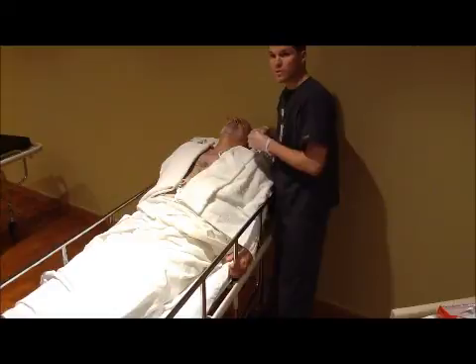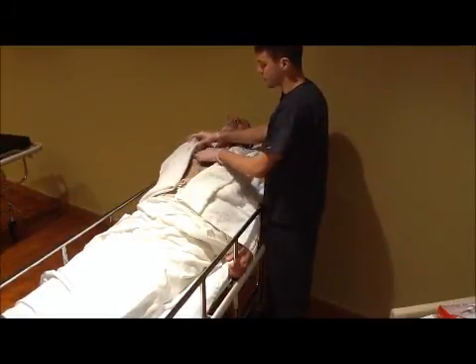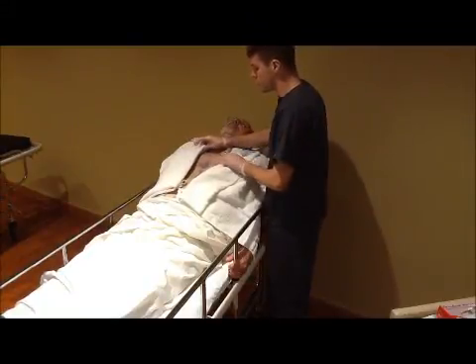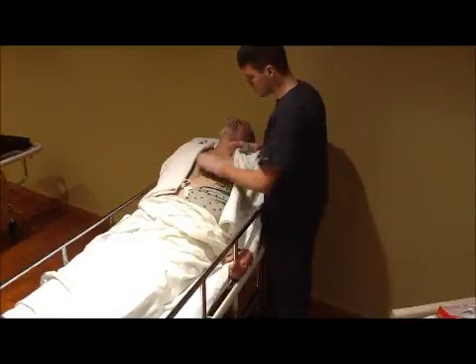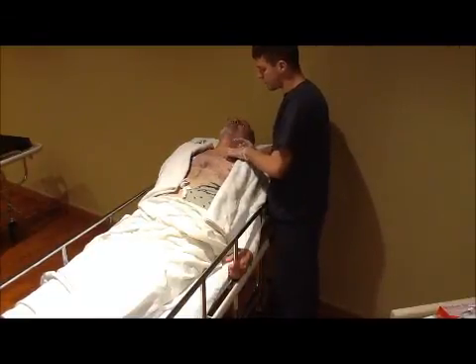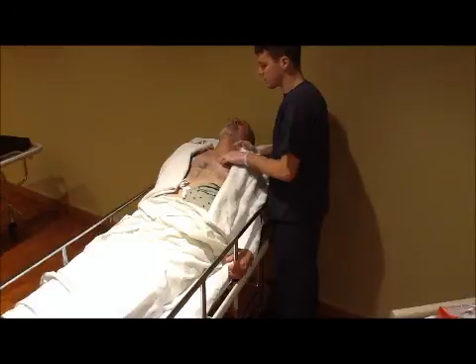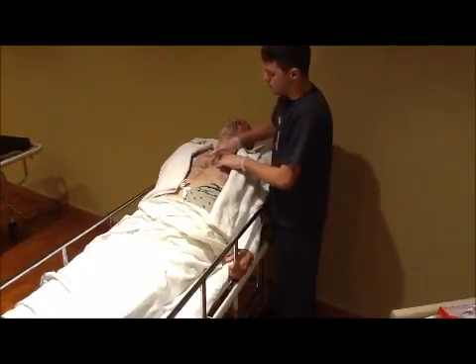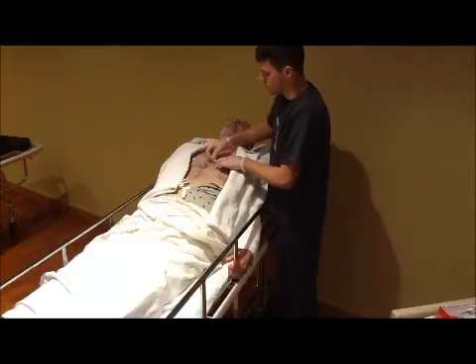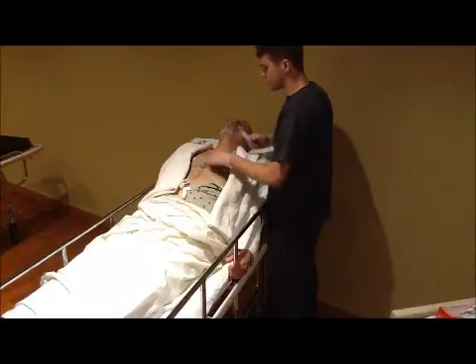The next electrode is V2, placed on the fourth intercostal space but on the left side of the sternum. Come directly across from V1 and feel for the nipple line. Count down: one, two, three, four — make sure to put it close to the sternum on that left side. Now you've got V1 and V2 placed.